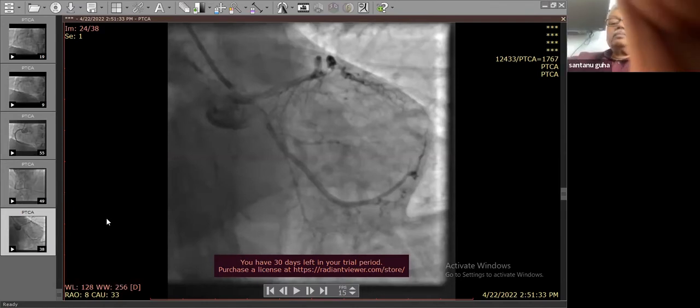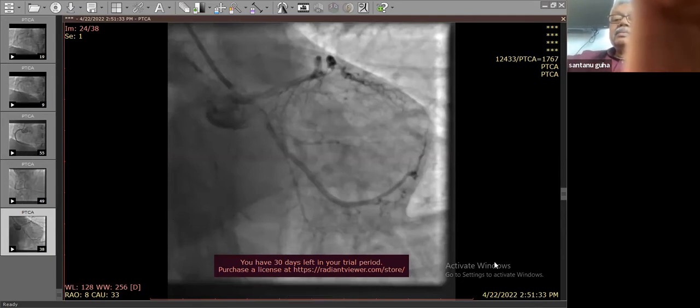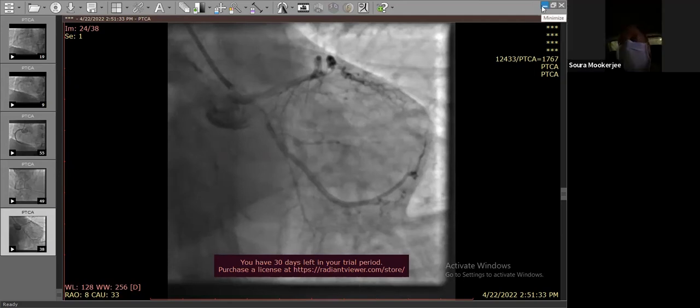Thank you, Basab. An interesting case. You landed in lots of problems, but it's open for discussion. So, Basab, how many times did you take check shots of the left system after you had retrieved that fragment? Sir, can you repeat the question? After you had retrieved the tip of that guiding catheter.